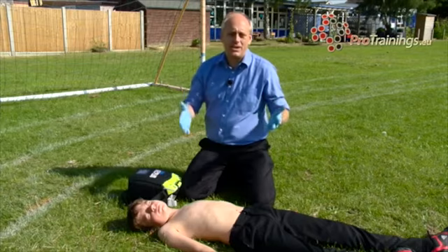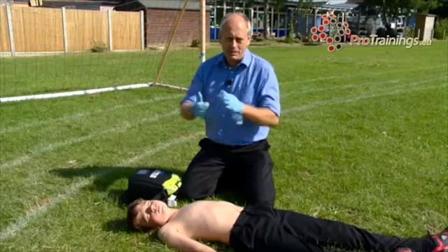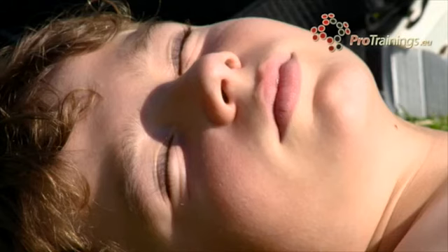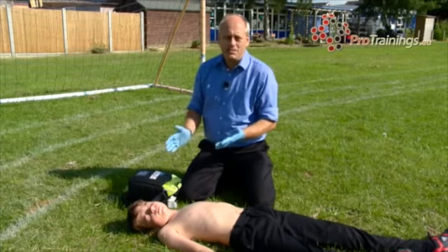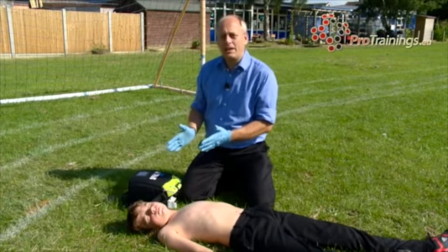What's happened is a child's been playing on a sports pitch and had a sudden cardiac arrest. We've been doing CPR. So remember, we're doing 5 breaths to start with, and then 30 compressions, 2 breaths, 30 compressions for standard first aid. Once the AED unit arrives, you may need to do some things with it, because here we're at a school, it may well be the AED unit is configured already for a child.